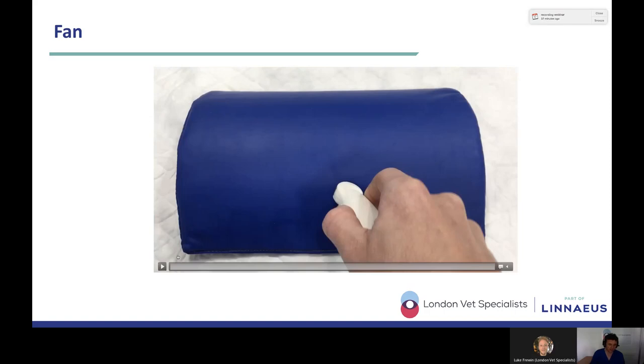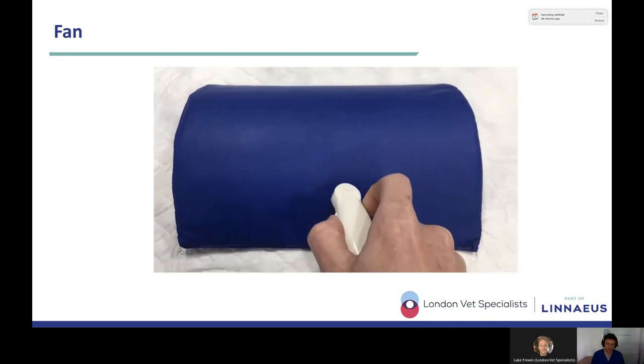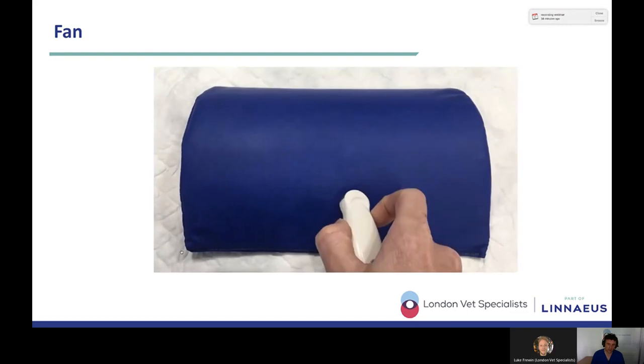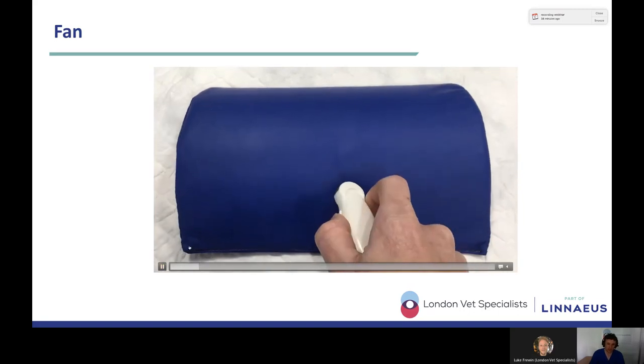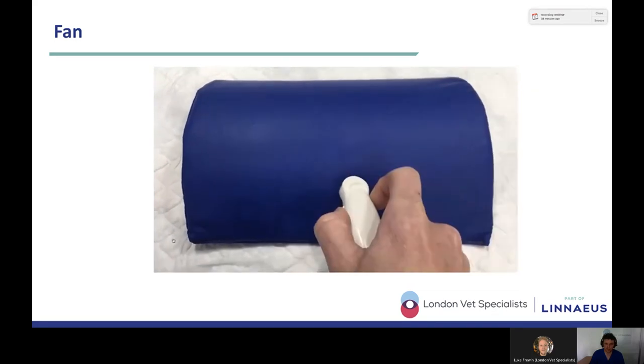And then we've got the fan. So a little bit like the rotate movement, the probe is in a fixed position, you are fanning your probe dorsally, you're fanning it ventrally. So the probe position doesn't change. You're trying to shine your ultrasound beam through the entire organ, whatever organ it happens to be that you're examining at that point. Probe is in a fixed position, fanning dorsally, fanning ventrally. Okay, so that's the fan.